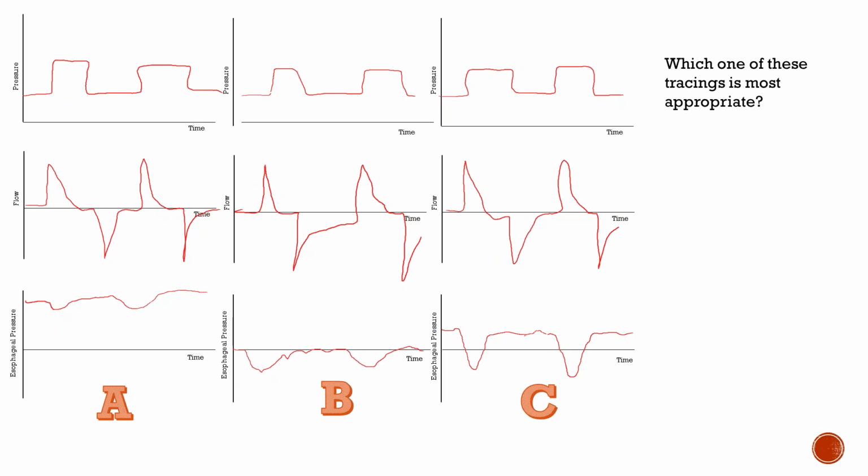Right. So for the esophageal pressure, I'm going to try my best to explain this. This was studied in EPVent, which was, I think, 3 or 4 years ago, and it showed a really awesome increase in oxygenation with esophageal balloon probe, esophageal pressure probe guided management of your PEEP.